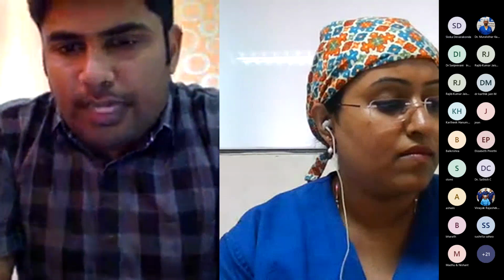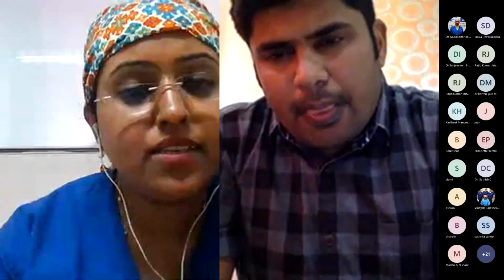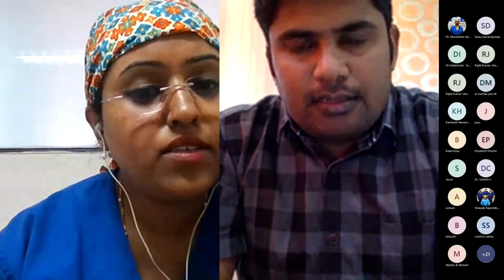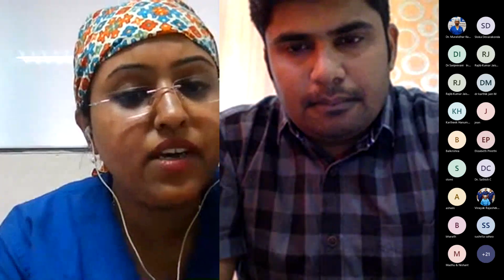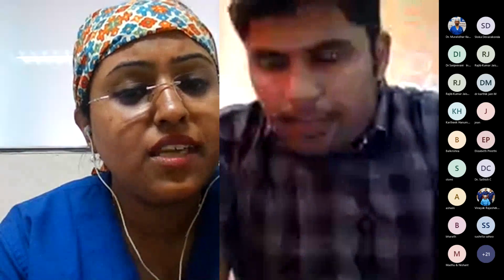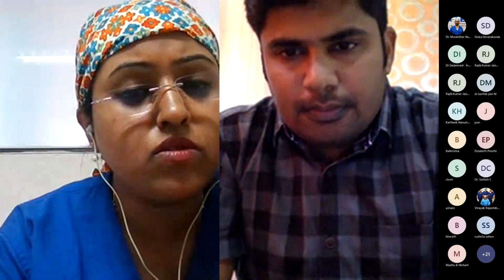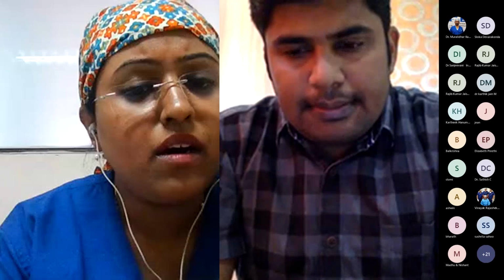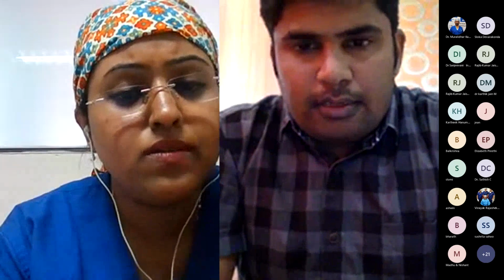Pooja, what is your idea? You were doing some study on this. Yes. On CT scan, it is much better seen, so that's the gold standard. On TEE and transthoracic, many times the speckles, because of the calcium, are very difficult to make out, so we underestimate most of the time. And if there is a dissection flap and a lot of shadowing because of the mitral tissue or other tissues, it's quite difficult to delineate the walls of the aorta if we are looking at aortic wall measurements. So CT is always the standard.